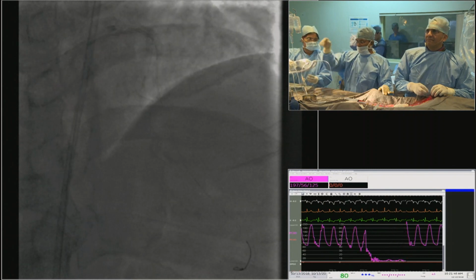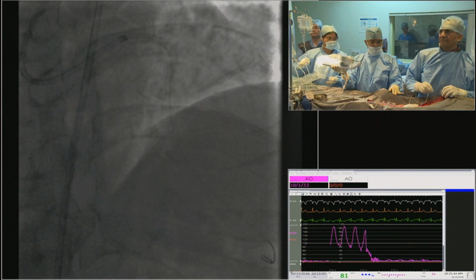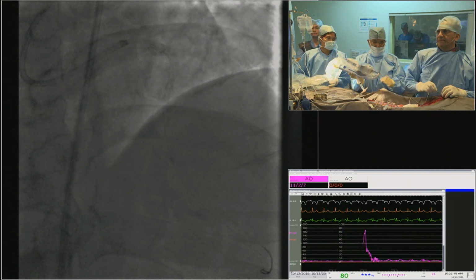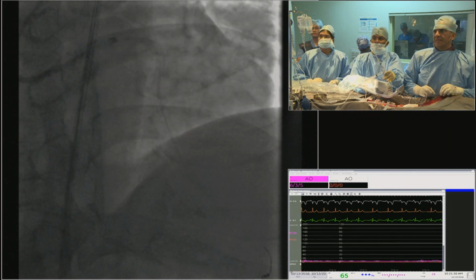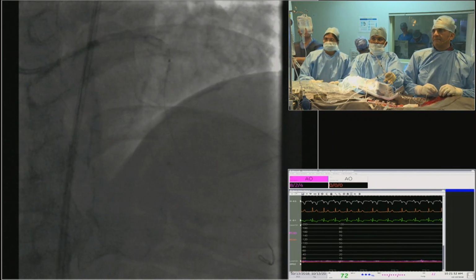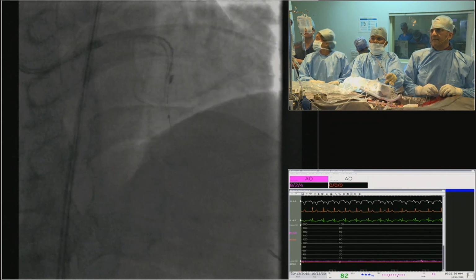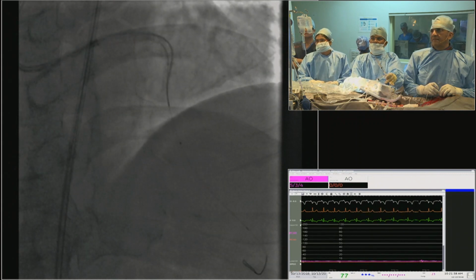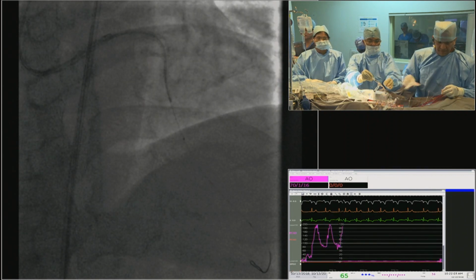Can I ask, Kirti, your edge of the stent is deployed at less than optimal pressure, that means less than 2.5. And we have not so far expanded. He is going to image, right? Yeah. Then he may re-optimize it. I'm not done with the case yet.